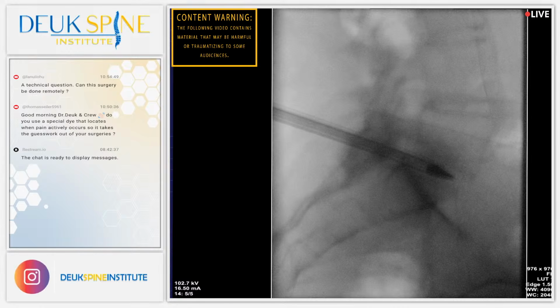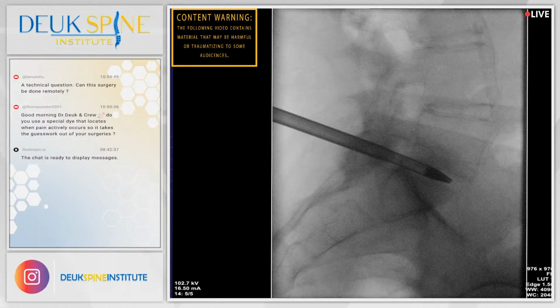So we do these surgeries under twilight anesthesia, which means the patient is not under general. If you have a patient under general anesthesia, you can sedate them until they're completely out. And it doesn't matter if they stop breathing or not, because you have a tube down their throat. It's ventilating their lungs, giving them oxygen, taking away carbon dioxide. When you have a sedation patient like this, you don't have the tube down into their trachea, so the patient can stop breathing, and it wouldn't be good for the patient. Let's put it that way.